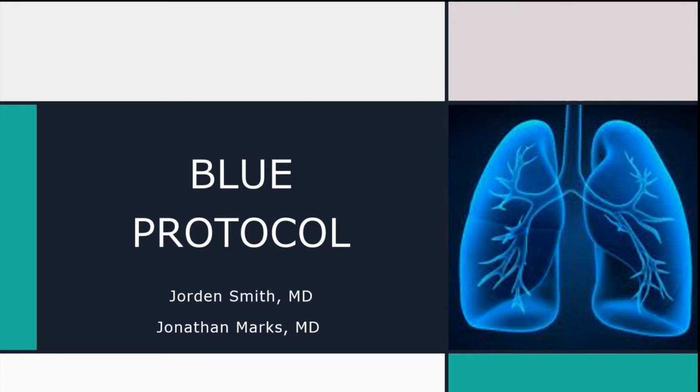Okay, so I am Jordan Smith, and in coordination with my partner on the POCUS rotation, Jonathan Marks, we are going to present the Blue Protocol as we are both interested in going into critical care medicine.